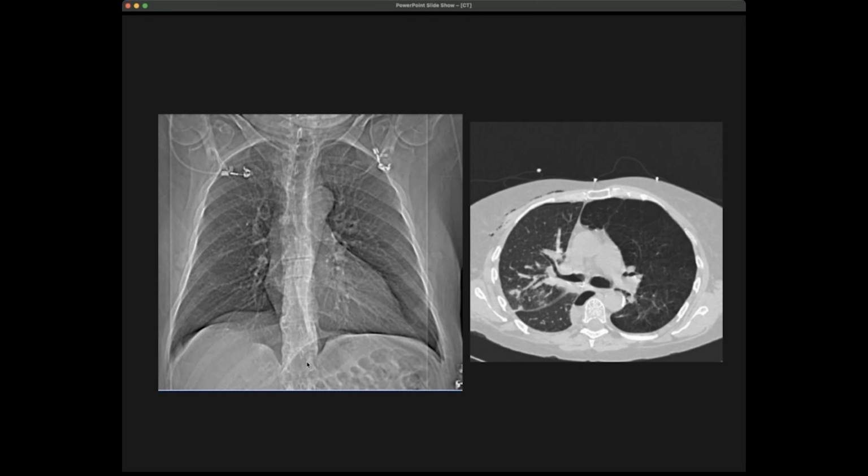Okay. So when we look at the images that we can produce, as I said before, this is a typical cross-section of the thorax. But one of the things is that when you want to scan a patient, for example, the doctor can prescribe to the radiologist and say, okay, I want a CT scan of the whole heart of this patient. So the technician that is doing the scan needs to position the heart.